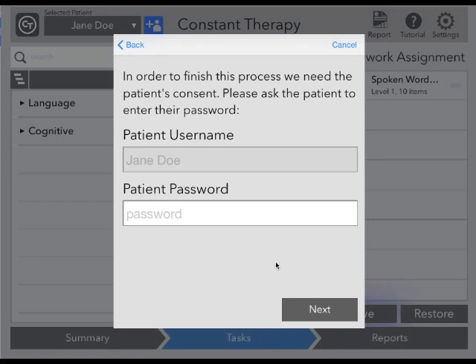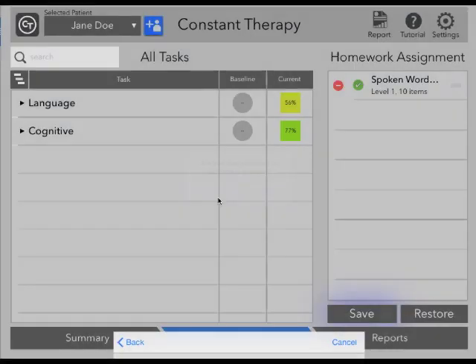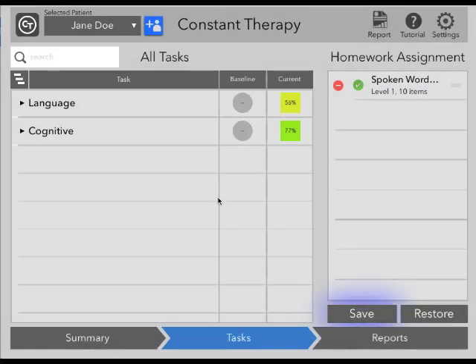Once your patient has entered their username and password, you will be able to enroll them with an existing clinician, or you can enroll them in Constant Therapy Direct. Our Constant Therapy Direct program is a system that will automatically select and assign tasks that are meaningful for this patient. This allows for continuity of care for those patients who wish to keep using Constant Therapy, but are no longer under your care.